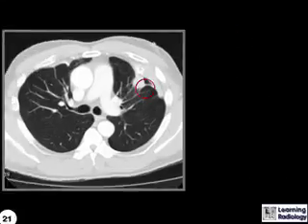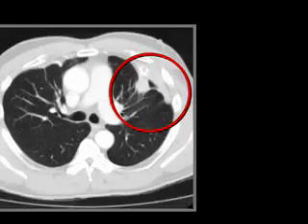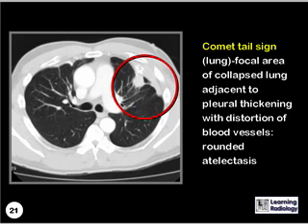What is the name of this sign? This is the comet tail sign, which is from a focal area of collapsed lung adjacent to an area of pleural thickening with subsequent distortion of the blood vessels. It's seen in rounded atelectasis, which is most often due to asbestos-related pleural disease.